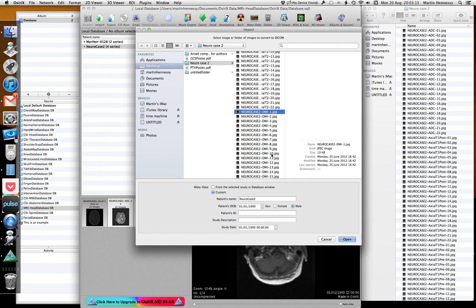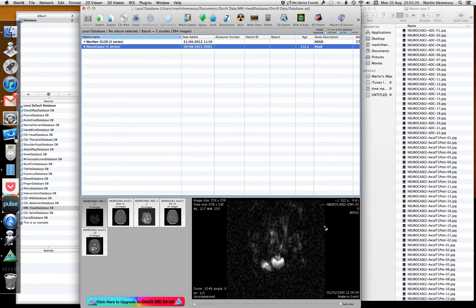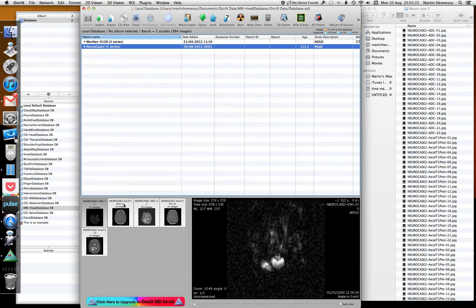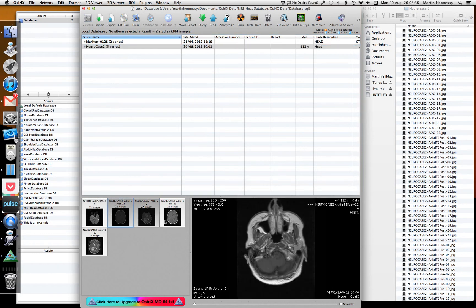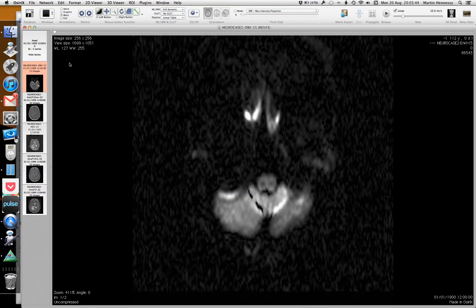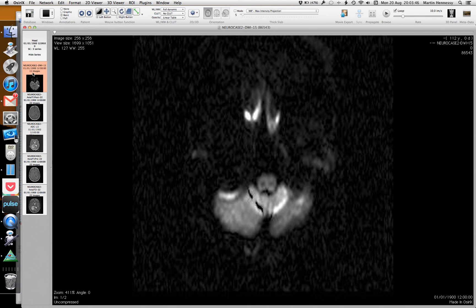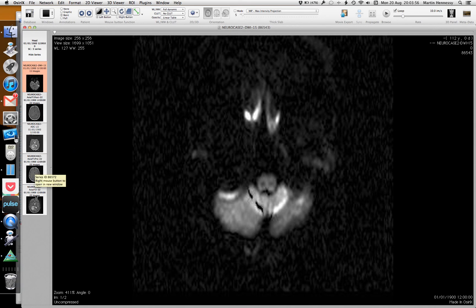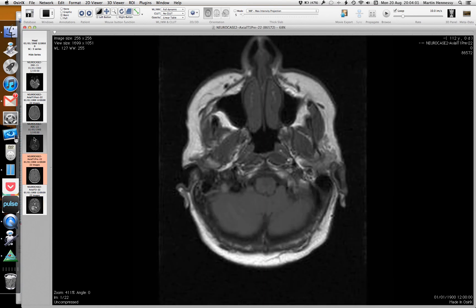Finally the DWI is imported. So I've now got my five series — they're all individual. They appear to have reverted to an order of their own which I can't drag to change, but that doesn't matter. If you double-click to view, you've got the cases there separately, and because we named them in Automator with the series description included, I know that's the DWI, that's the Axial T1 Post Contrast, ADC, etc. So you can flick between them as needed.